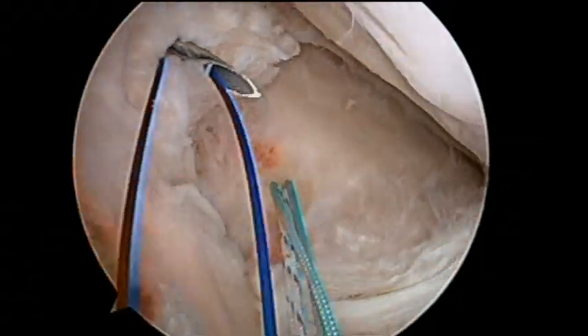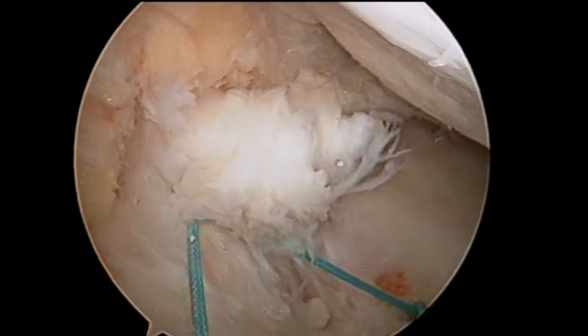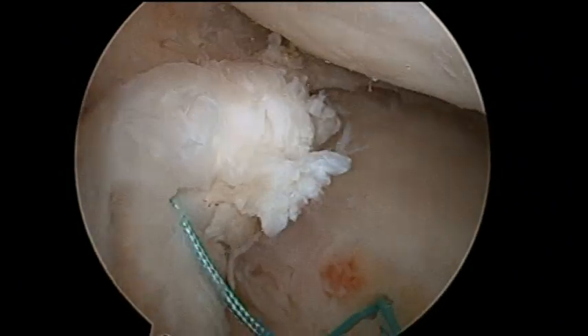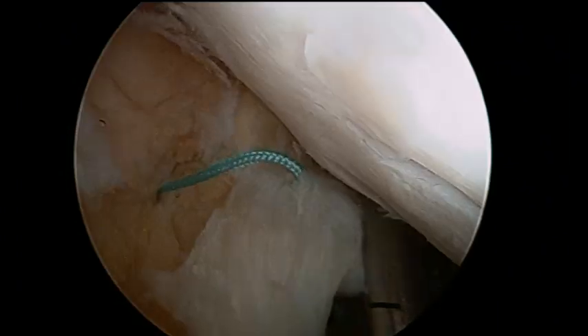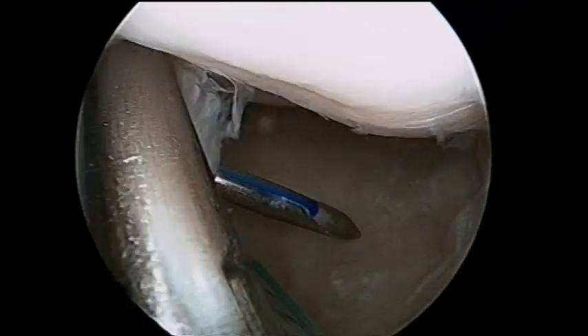One end of the green thread is inserted through the monofilament loop to pass it through the meniscus. The previous step is repeated to retrieve the second end of the green thread.